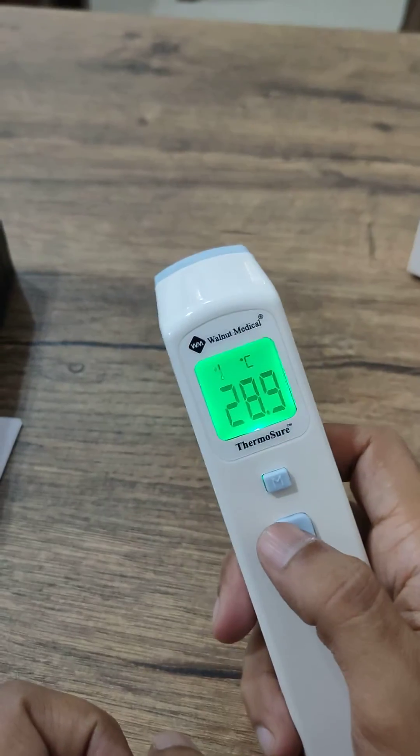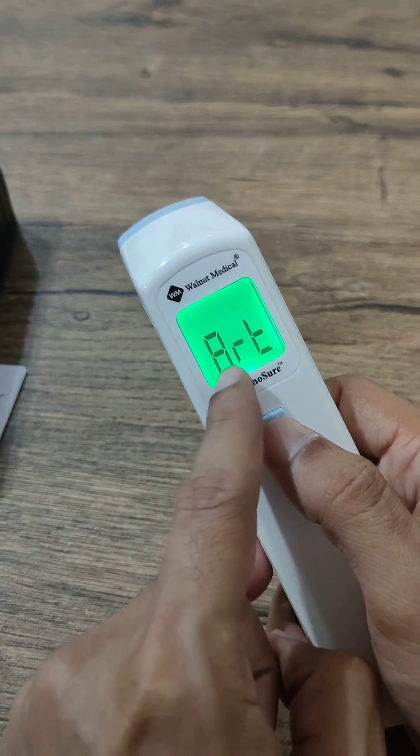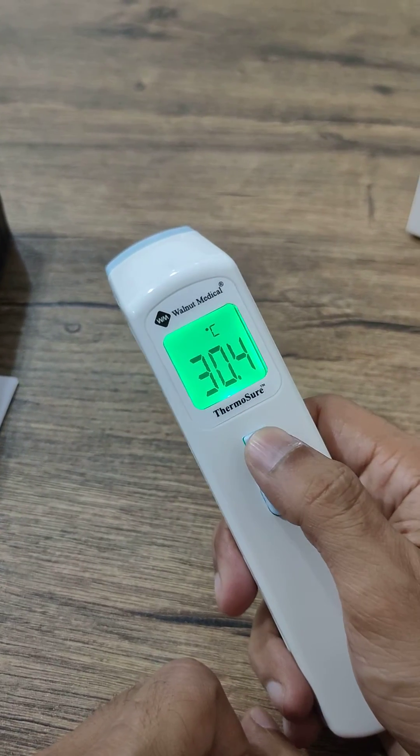In OST mode, I can take the surface temperature right now — it's 28.9°C. Moving forward, this is ART mode — ambient room temperature mode. The room temperature right now is 30.4°C.